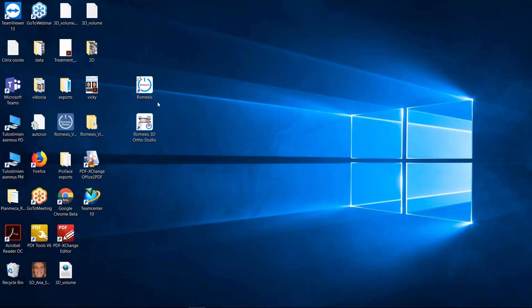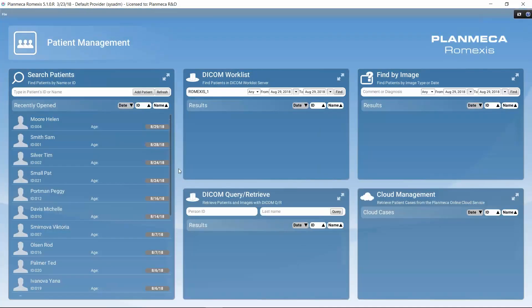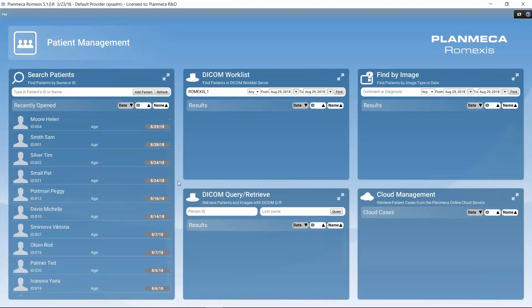I have Romexis installed on my computer and I can start it by double-clicking on the icon. When opening Romexis directly like this, without first selecting a patient in a practice or patient management software, this is how Romexis gets opened. In the upper bar we can always see the current version number of Romexis and which user is currently logged in.